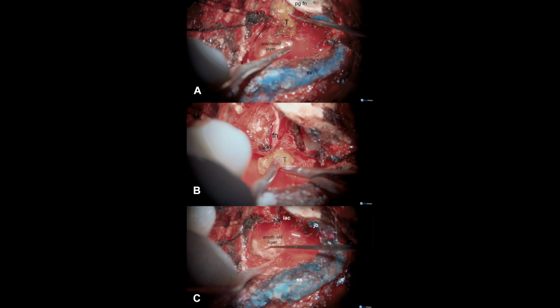In the next sequence, Panels A, B, and C, most of the tumor has now been removed. The entire intracranial component, the part compressing the brainstem, has been taken out first. Only the portion within the internal auditory canal remains. In Panel A, I have opened the IAC dura and am removing the final fragments of tumor.